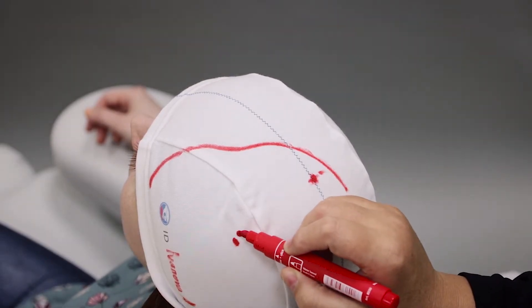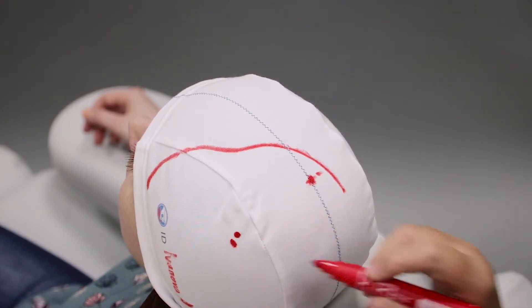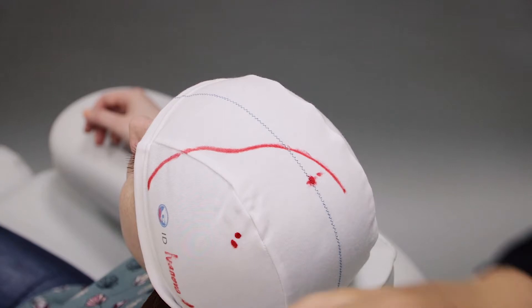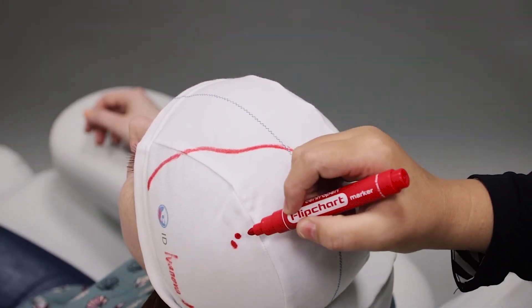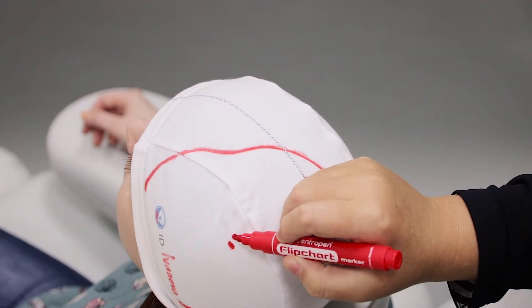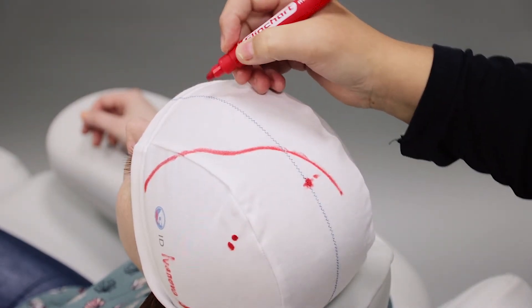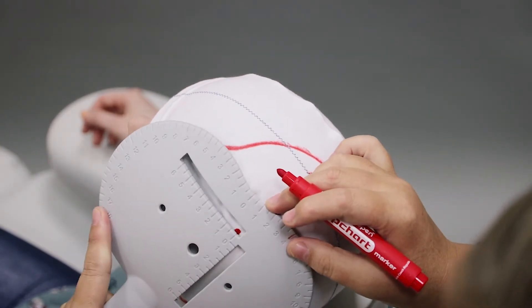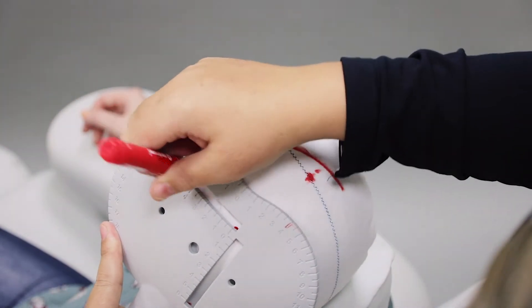This point is C3. Now, using the ruler built into the coil positioning tool, I measure a distance of 5 centimeters forward from this point, parallel to the sagittal line of the cap, and mark that point.